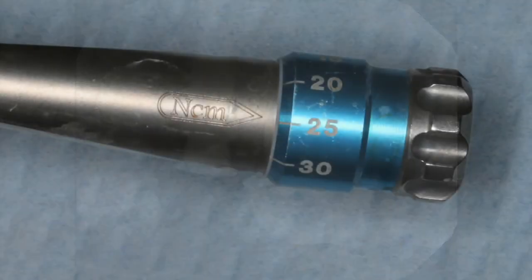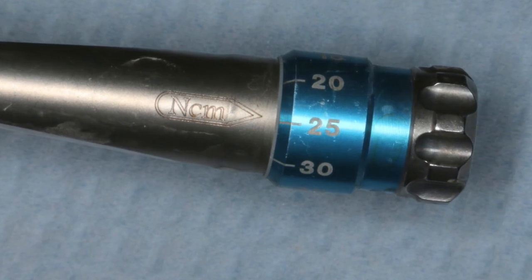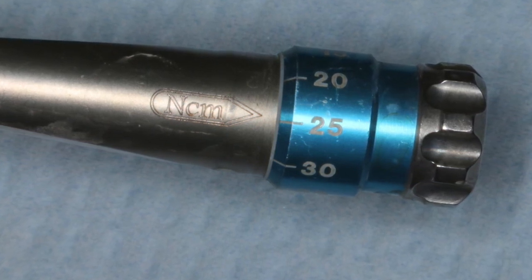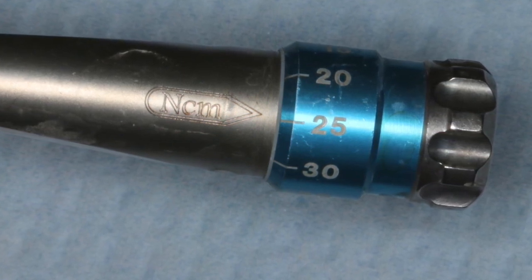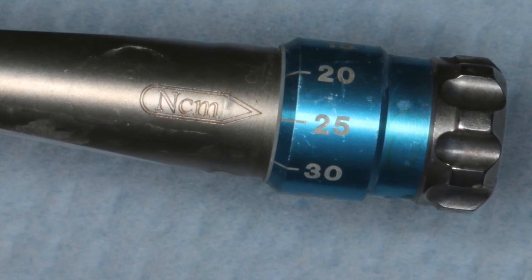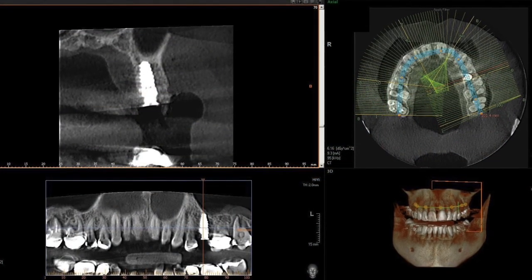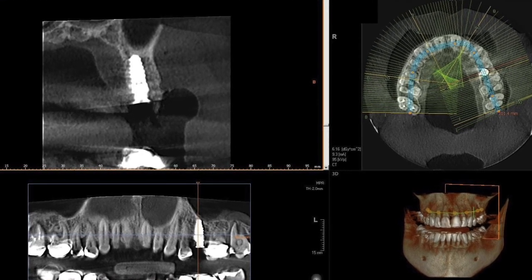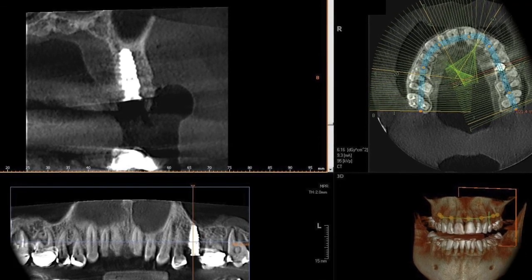We will torque that healing abutment to 25 newton centimeters, which eliminates it coming out of the mouth. Oftentimes if you hand tighten, the tongue will find that area and loosen it — patients will call and say they lost their implant, but obviously that's not the case. If you're able to torque to 20-25 newton centimeters, that healing abutment is not going to come off. The post-operative CBCT shows really nice position of that implant in solid bone at the floor of the sinus, and I feel very comfortable with our surgical application.